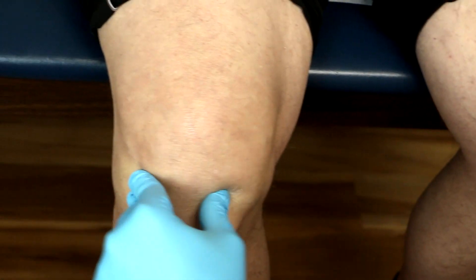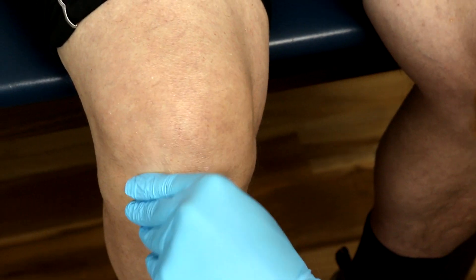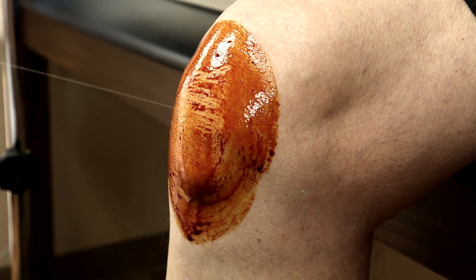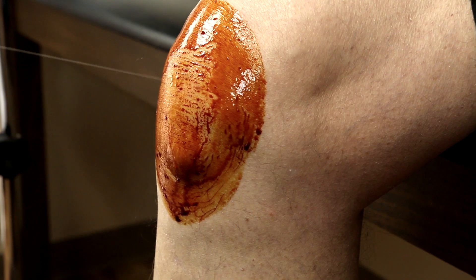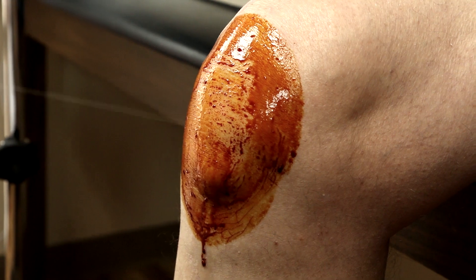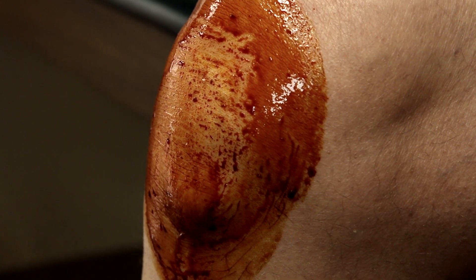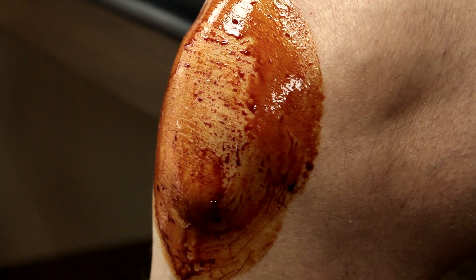We're going to go above it — it's not going to be a problem. So what is that? It's called ethyl chloride, and its only job is to evaporate. And as it evaporates, it makes you very, very cool.